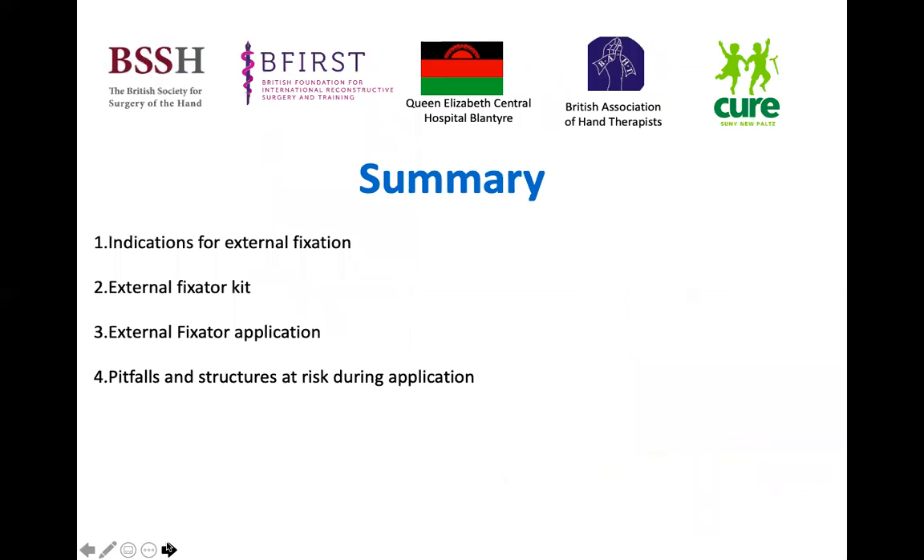In summary, we've run through the indications for external fixation, gone through a common external fixator set and how to apply an external fixator, as well as common pitfalls.